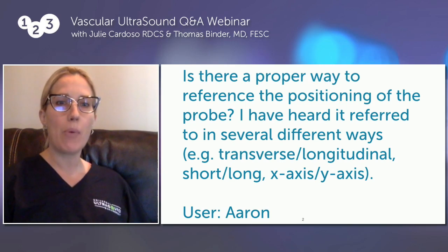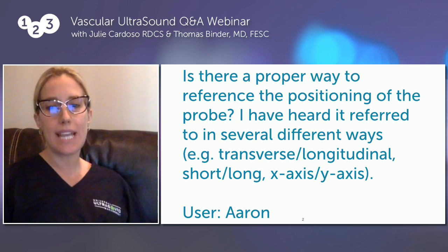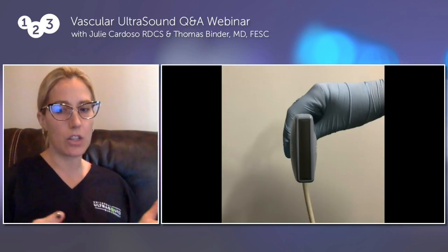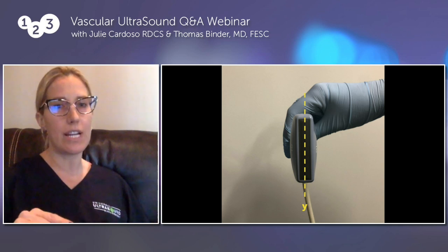It says, is there a proper way to reference the position of the probe? I have heard it referred to several different ways: transverse, longitudinal, short, long, x-axis, and y-axis. So the common mistake is that we mix the reference to the anatomy versus the probe itself. So transverse and long refers to how you're imaging the vessel anatomy.